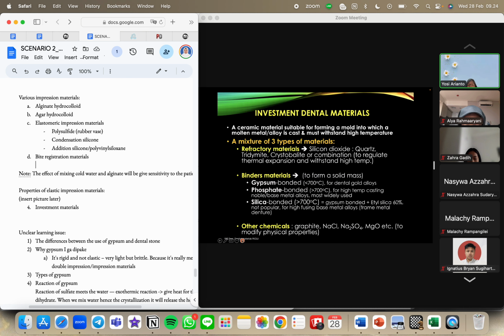Okay. Last one is the investment dental materials. Yeah, this is actually a ceramic material. Yeah, like gypsum, it is also ceramic. It is used to form a mold into which a molten metal or alloy is cast and must withstand high temperature.